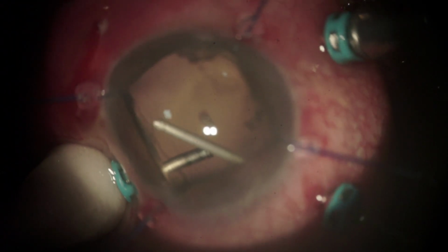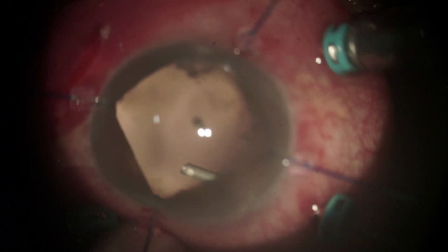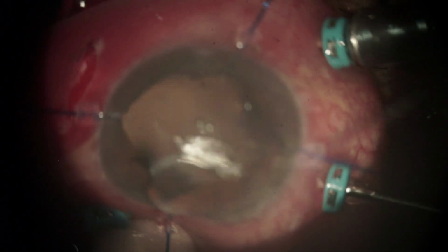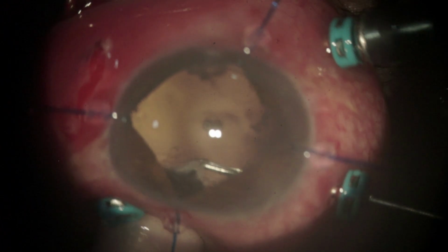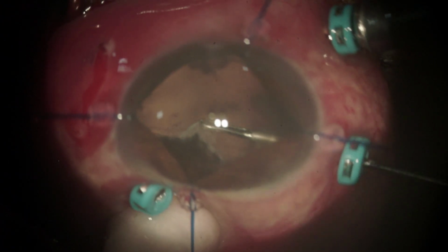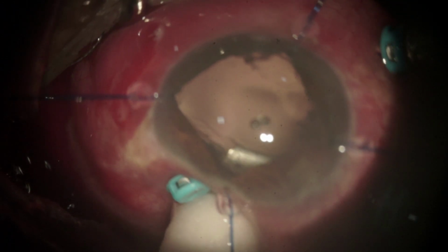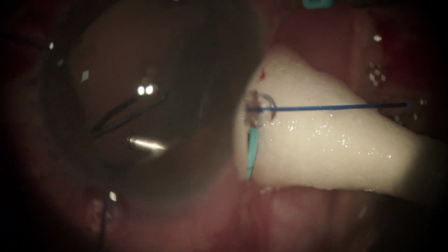The most crucial step is the dissection of membranes over the ciliary body. Extensive external indentation of the pars plana region allows adequate visualization of the ciliary body. The membranes are released with intraocular forceps without causing undue pulling, and then cut with low vacuum high cut rate settings.